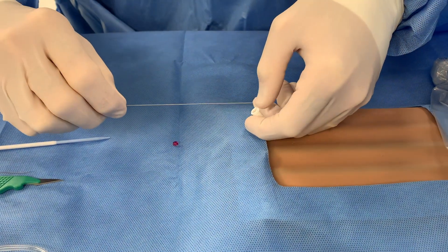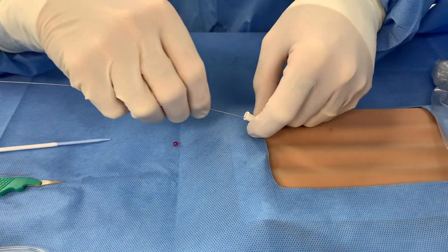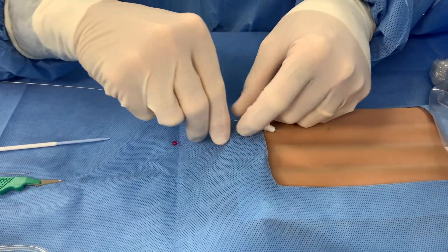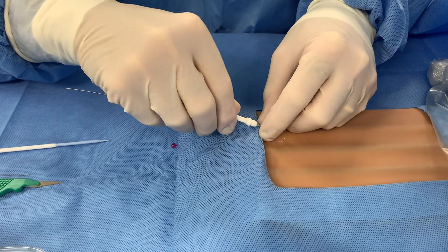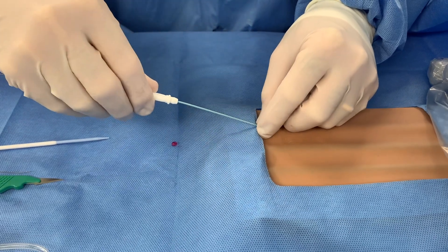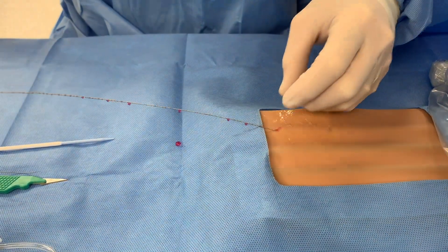Advance the 0.025 inch RIC guide wire through the introducer catheter and remove the introducer catheter, leaving the RIC guide wire in place.